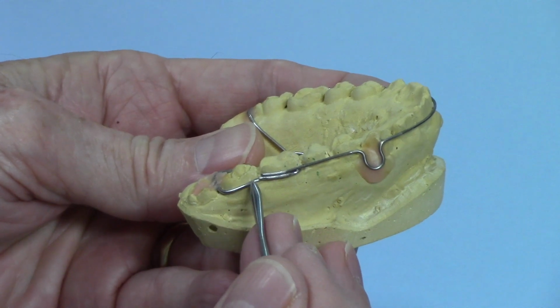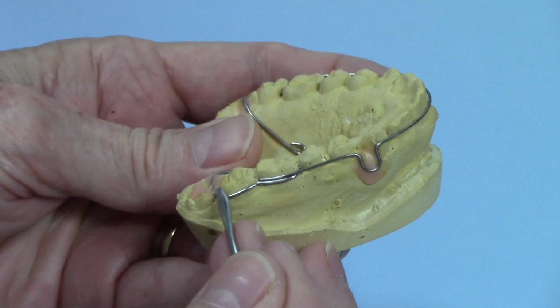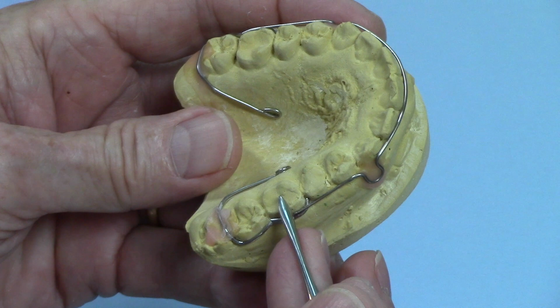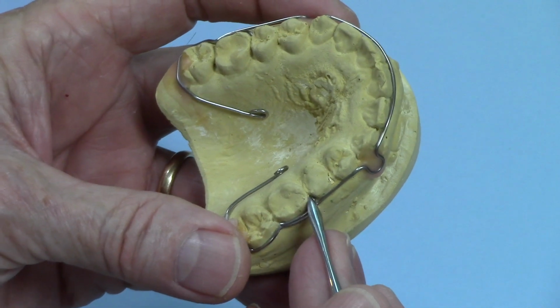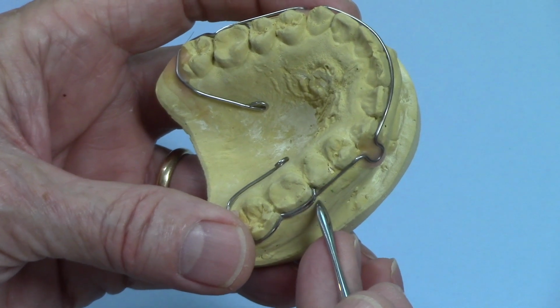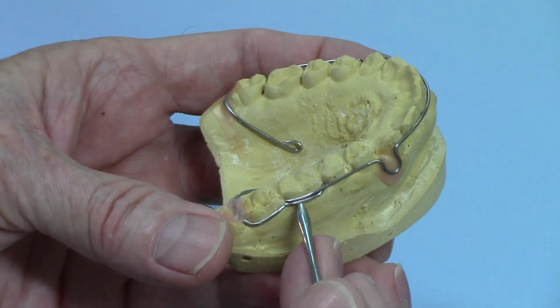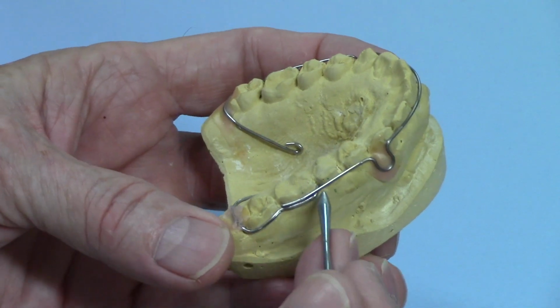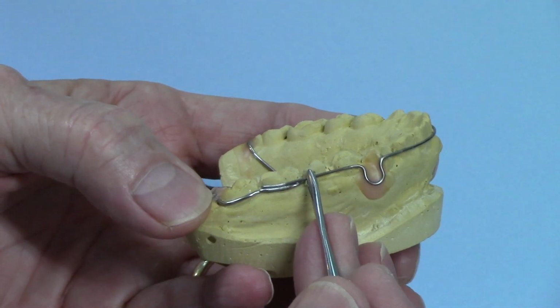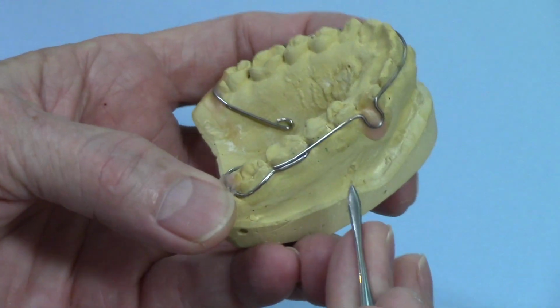Now the 036 is like a circumferential clasp modified, where it goes from the distal of the second molar up to the embrasure between the second bicuspid and the first molar. Now this is where the retention is. So I round this 036 wire off, I tuck it into the embrasure good and snugly so that it has a good retention value, and then it comes around distal into the acrylic, and then soldered to that is the 030 retainer wire.